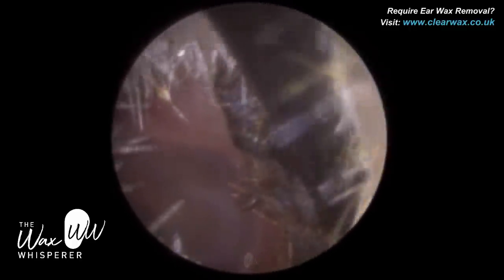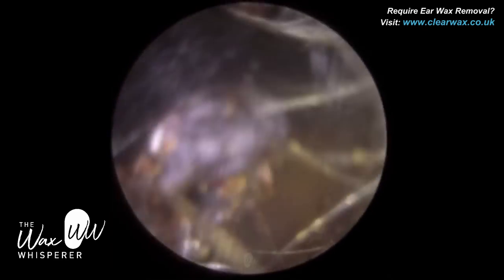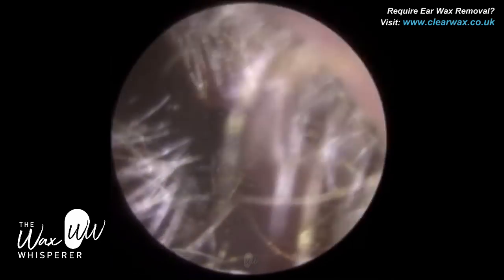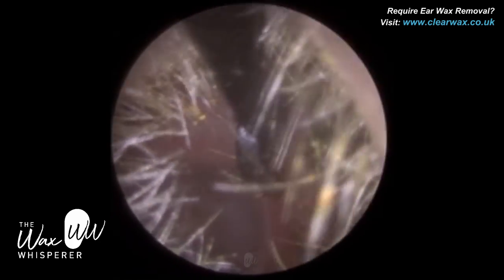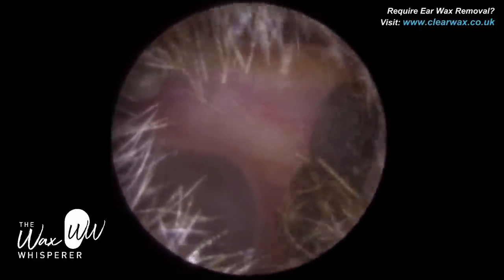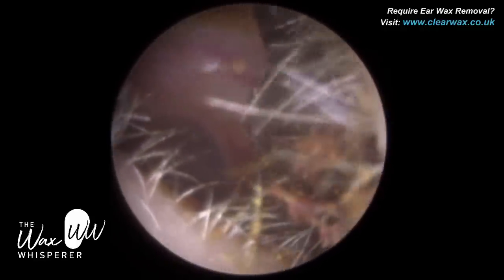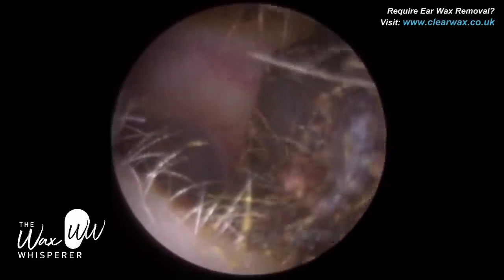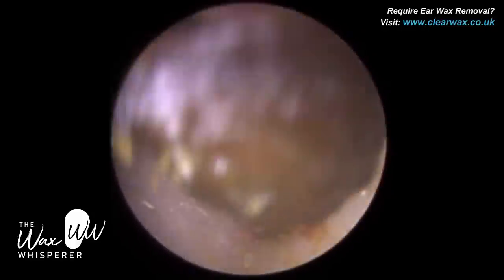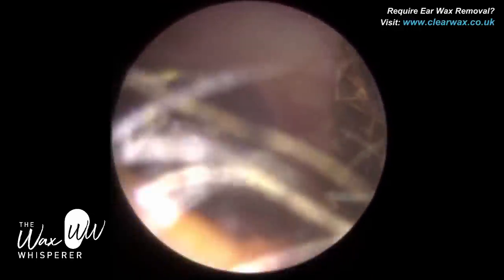It's not too wet, it's not too hard — it's almost got a fudge-like consistency. So it does stick to the ear canal wall at times, and when you're trying to lift it off, you have to be careful because I don't know the thickness of this layer of wax against the canal wall. We don't want to apply too much pressure and make contact with the canal wall, which would be very uncomfortable. So I'm being cautious, taking it nice and slowly, layer by layer — it's almost like an onion.